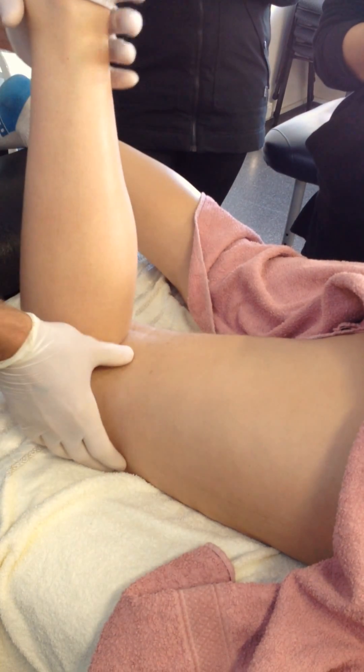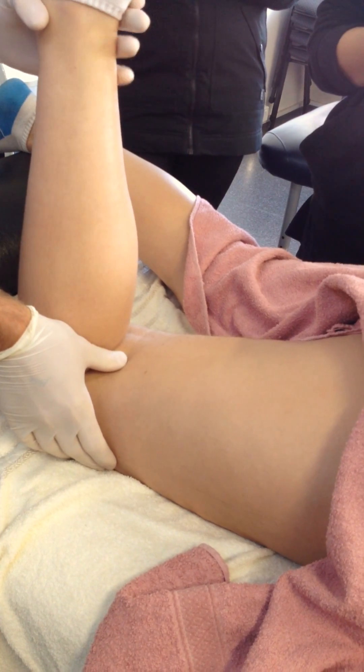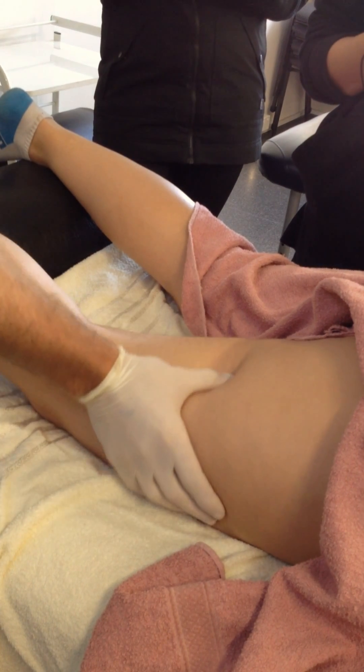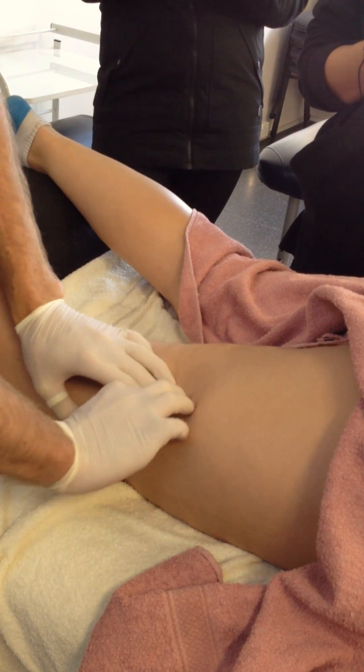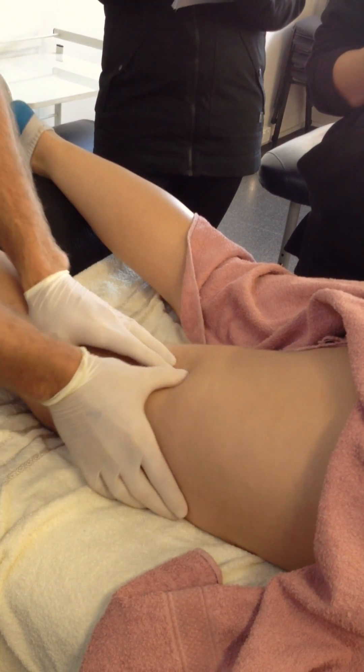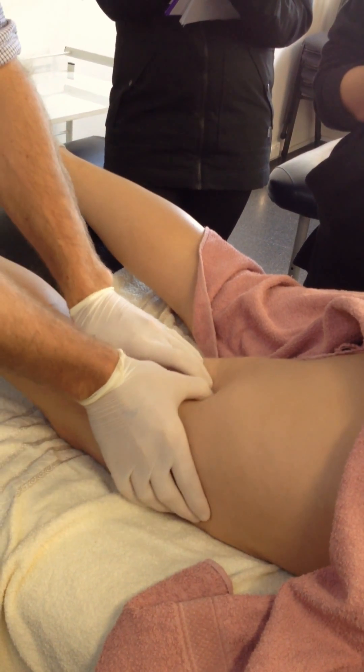We can differentiate these via internal and external rotation of the knee, getting the patient to actively do it, and palpating the contractions medially and lateral. Palpating through the muscle, trigger points generally arise in the distal half of the muscle, so that's the spot we tend to go for.